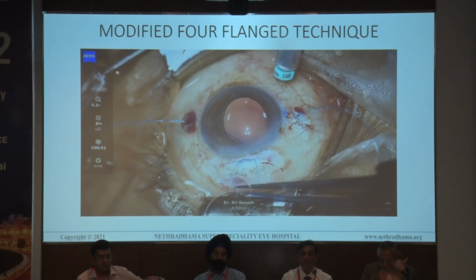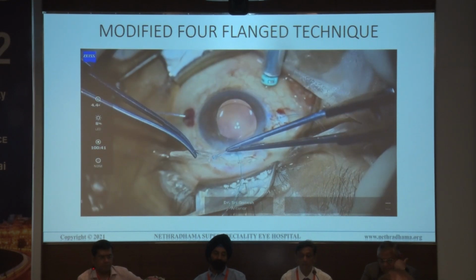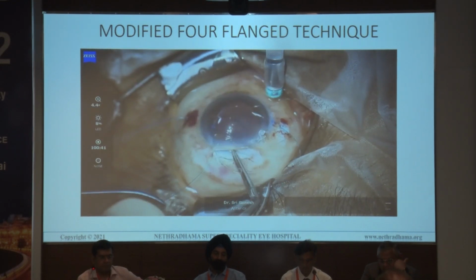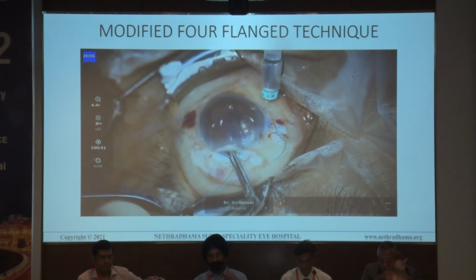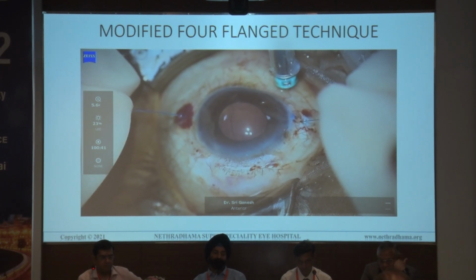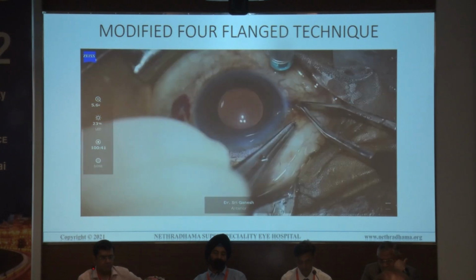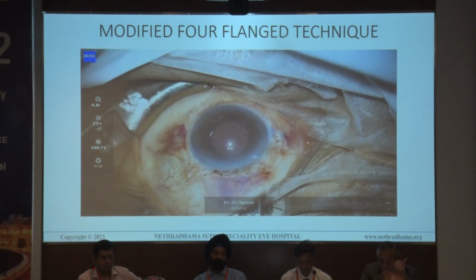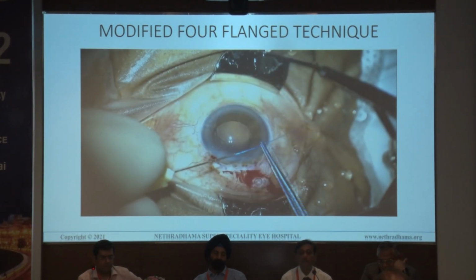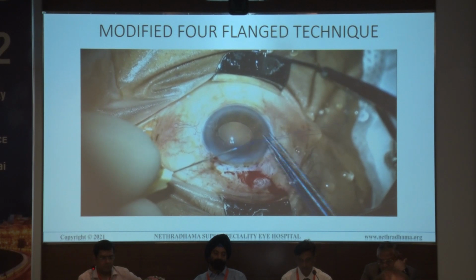Now the suture ends are passed to the eyelets of a PMMA IOL and cauterized to create flanges, following which the IOL is positioned behind the pupil. Outer sutures are pulled anteriorly and cauterized to create 2 external flanges, which are then buried under the conjunctiva. We believe that this modification may be useful by reducing the maneuvering inside the chamber, as docking of the suture is already performed outside the eye.